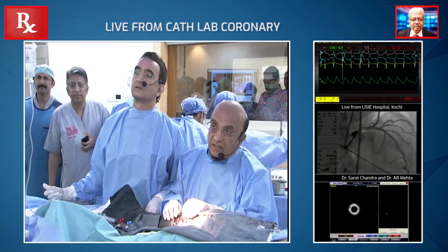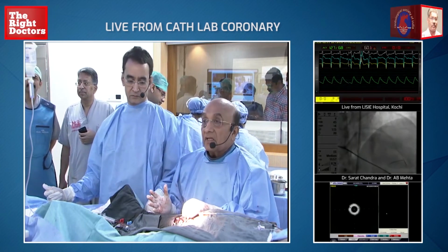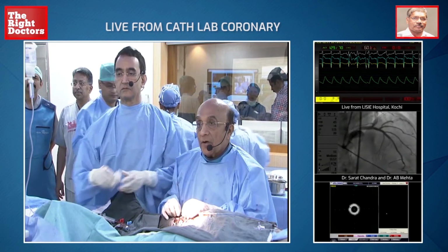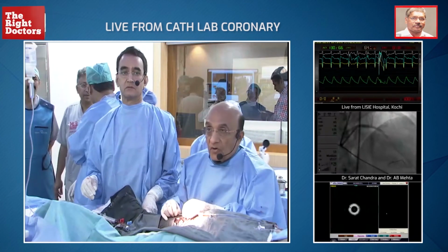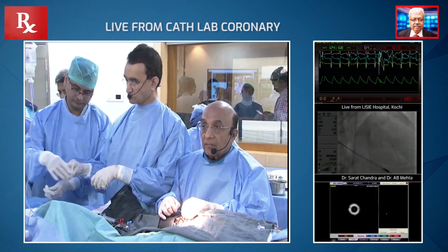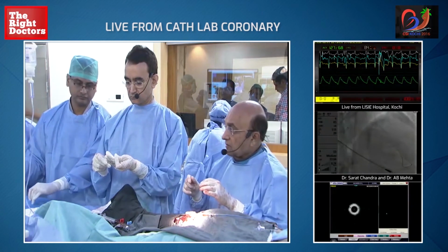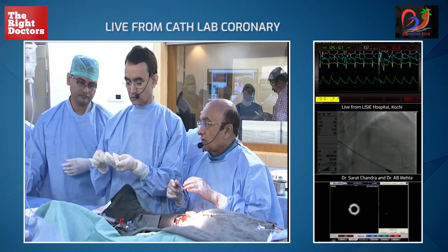The final crossing in the side branch and the main branch with the wires is 98% with the DK cross, which is much lower in the mini cross technique. So this is where we are now at this point of time. Let me see if the time permits, then I'll push the wire into the side branch. All right.